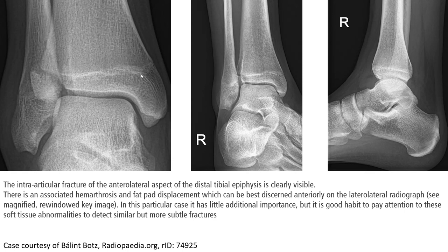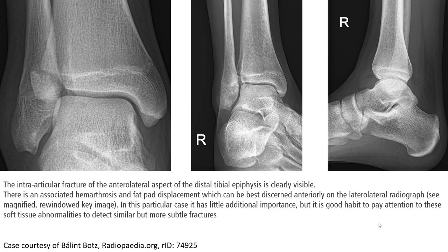Another example shows an intra-articular fracture of the anterior lateral aspect of the distal tibia epiphysis, which is clearly visible. There is an associated hemarthrosis and fat pad sign displaced, which can be best seen on the lateral radiograph. While in this particular case it has little additional importance, it is good to pay attention to this abnormality to detect similar but more subtle fractures.